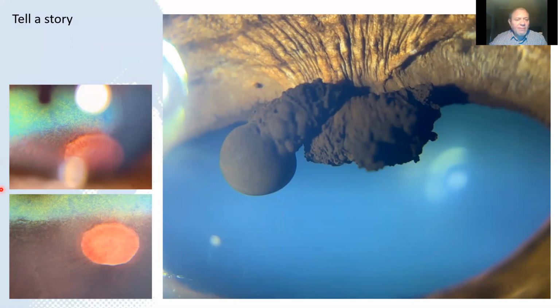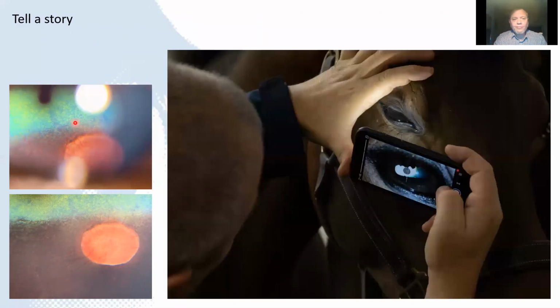The still image in the bottom left is a beautiful image. You can see the vessels very clearly. You can see the ganglion cell layer as it starts to become myelinated as it comes close to the optic nerve head. We can't get that same feeling of the shadowing that we see in the moving image. So when we're telling our story, we're going to start off with looking at the visual axis, which is what this shadowed GIF is telling us, I guess.